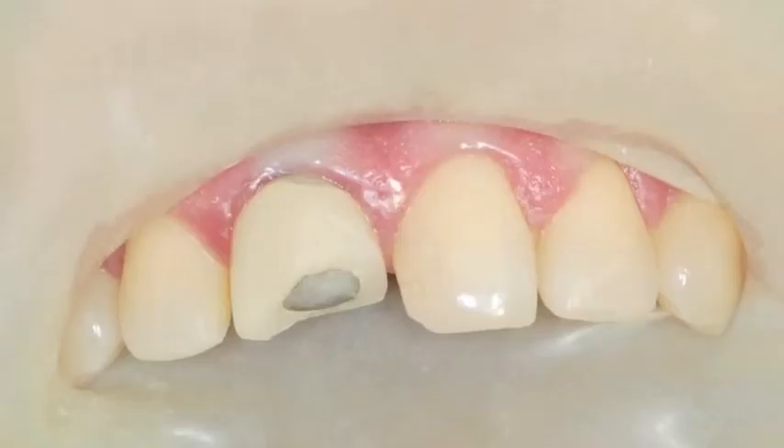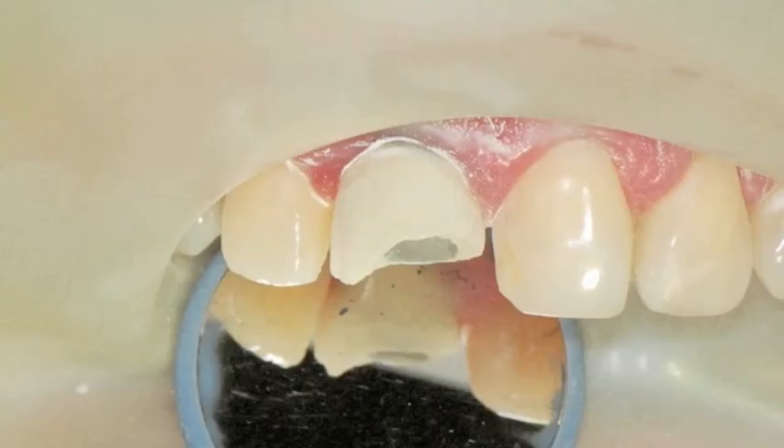Forks and porcelain don't always get along. This patient was visiting from out of town and fractured the incisal one-third of the porcelain fused-to-metal crown covering tooth number eight, the upper right central. Since he was returning home the next day, it was decided to do a porcelain repair. A standard porcelain veneer prep was placed into the existing crown. The metal and porcelain was prepared on the facial and lingual surfaces. The entire preparation was micro-etched with the SilJet and then treated with the silane coupling agent, S-bond.